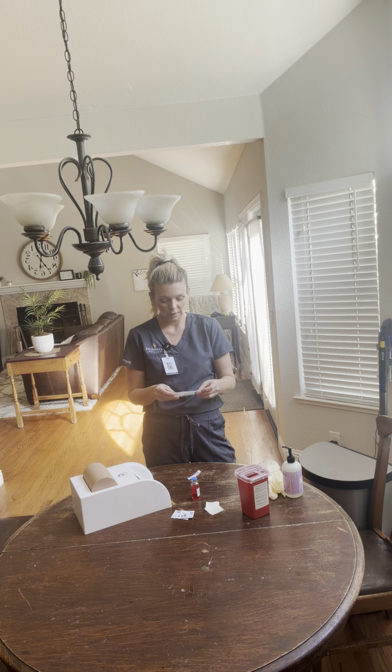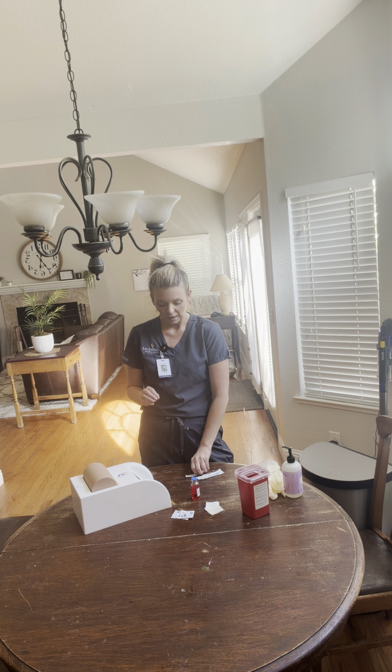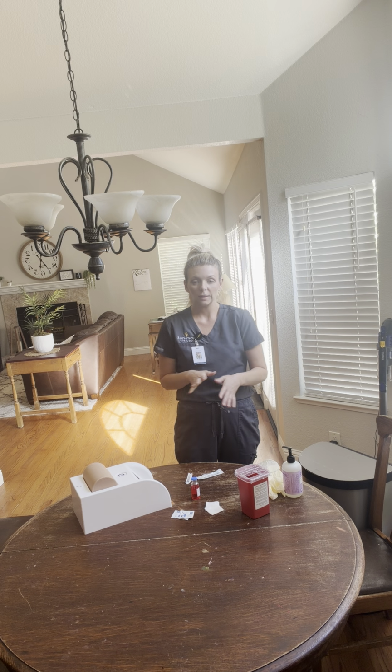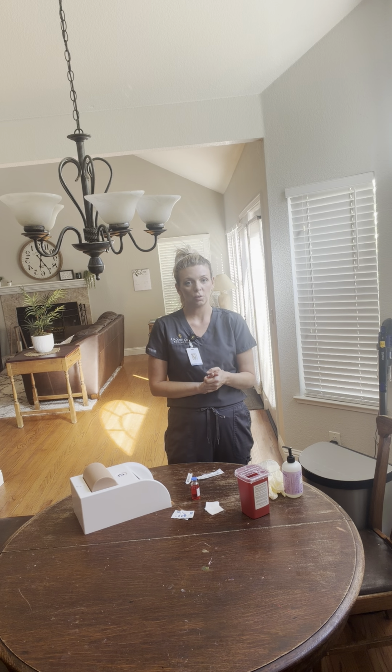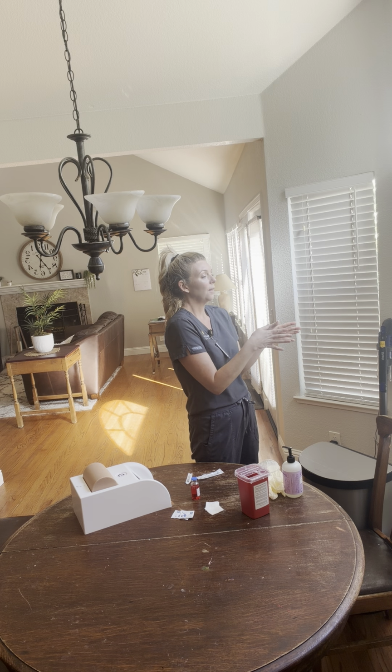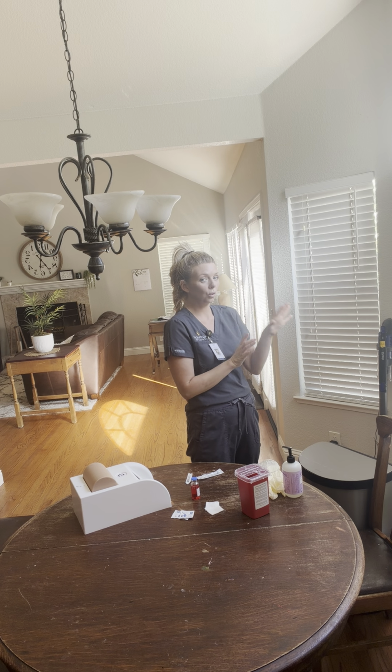I have my 3 milliliter syringe, and today for this demonstration we are going to be using a 22 gauge by 1 inch needle. So the first thing that I'm going to do is go over my provider's orders. My provider has ordered 6 milligrams of morphine sulfate administered intramuscularly, and so I'm going to make sure that I look at the EHR and the MAR in the order together.